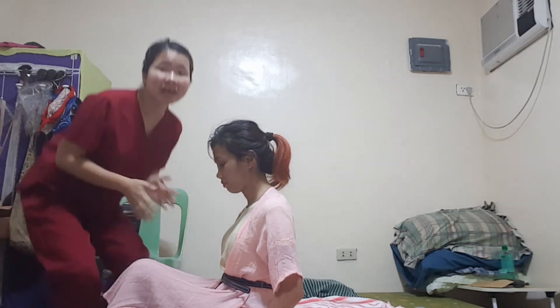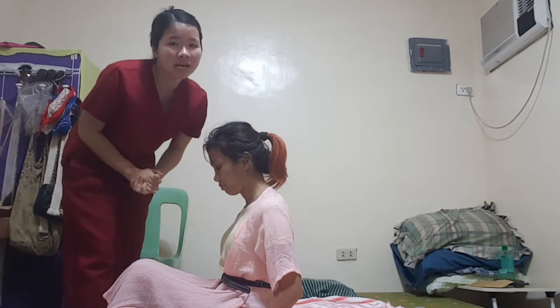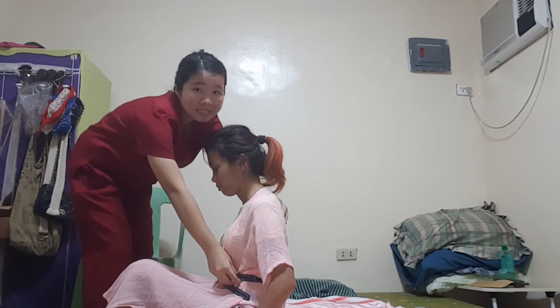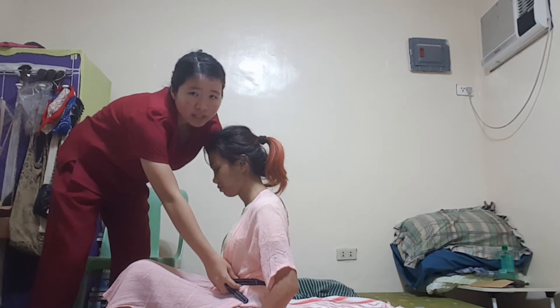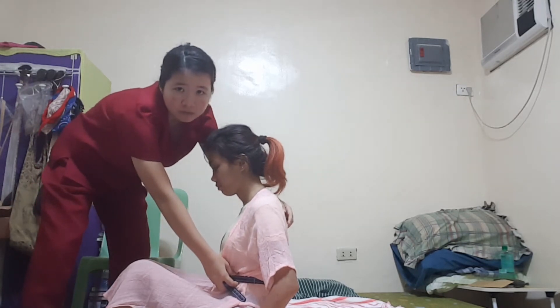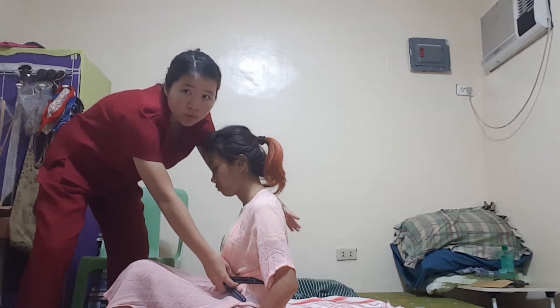For procedure number fourteen: stand directly in front of the client and to the side requiring the most support. Hold the gait transfer belt with the nearest hand, and the other hand supports the client's back from the shoulder. Lean your trunk forward from the hips; flex your hips, knees, and ankles. Assume a broad stance, placing one foot forward and one back. Brace the client's feet with your feet to prevent the client from sliding forward or laterally, and mirror the placement of the client's feet if possible. Assessing balance and strength helps identify the need for additional assistance when there are risks of falling.